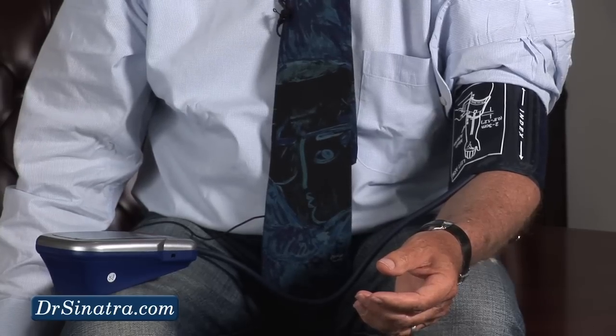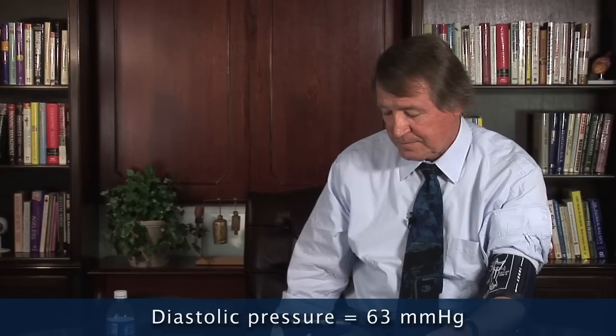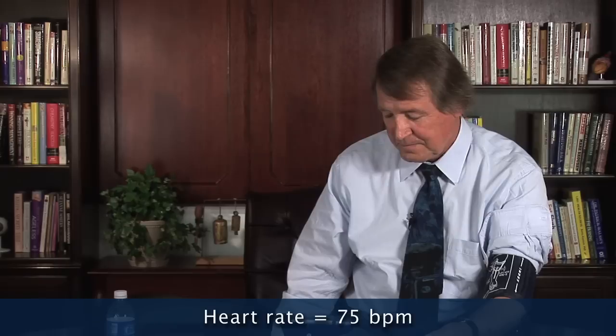Let's see if it blows the cuff up. Memory 1. Your systolic pressure is 105. The diastolic pressure is 63. The heart rate is 75 beats per minute.